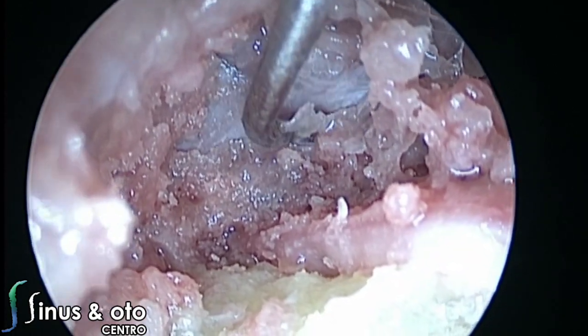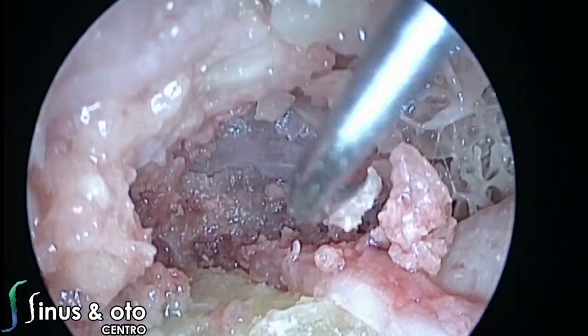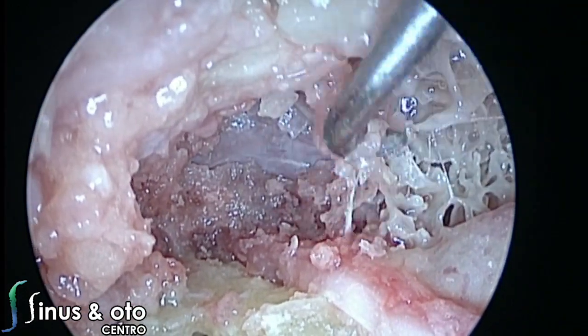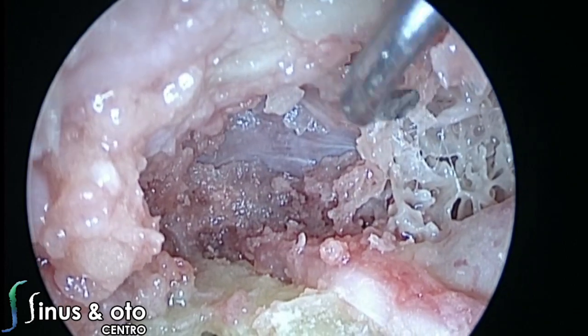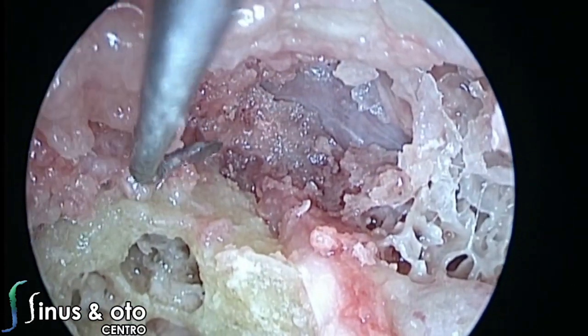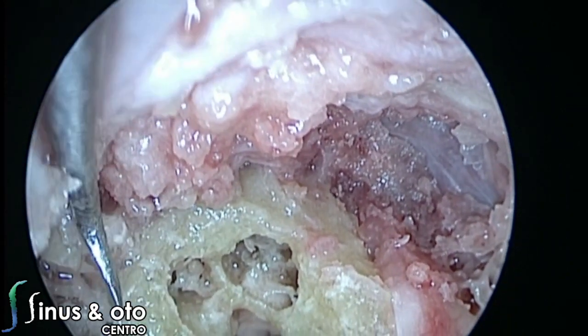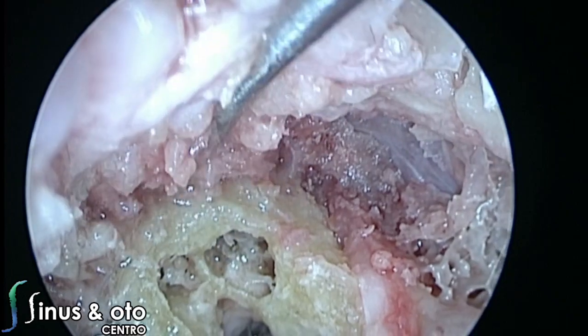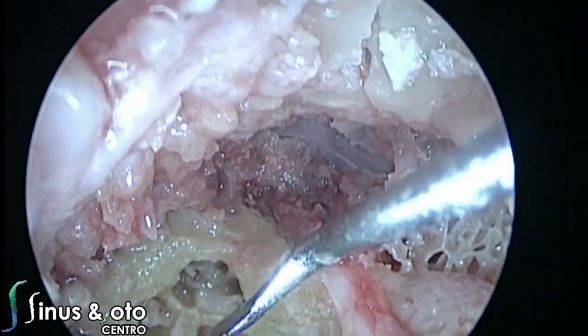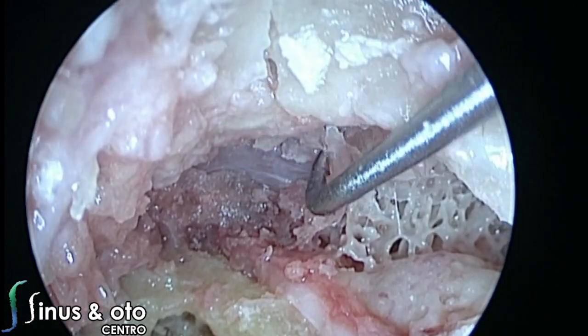You can dissect the middle fossa dura completely, and you can see that once you pass the cog, the middle fossa dura stays more superior, in a more distant configuration from these structures. So you have the hypotympanic cells. The muscle is completely displaced to the most anterior part. The middle fossa dura is there.